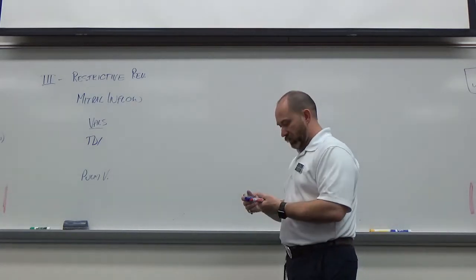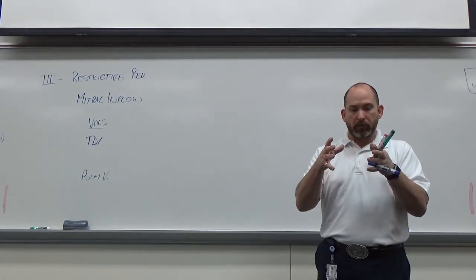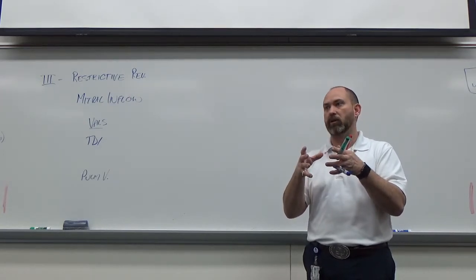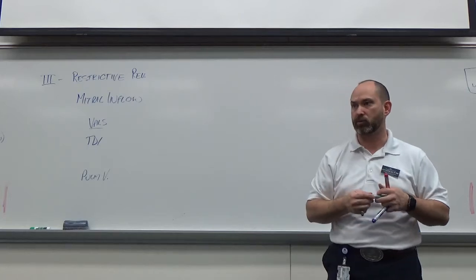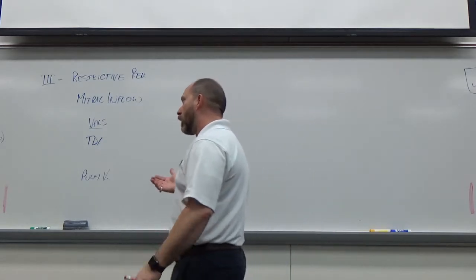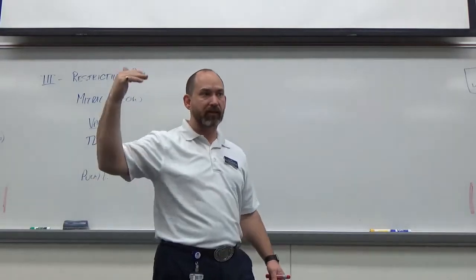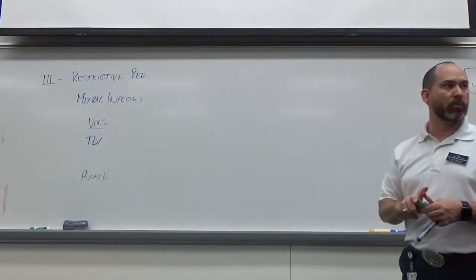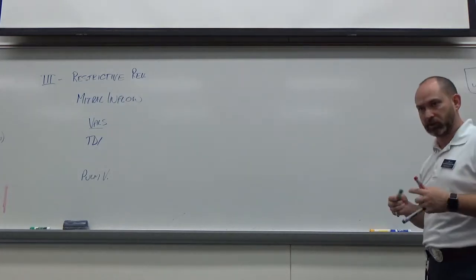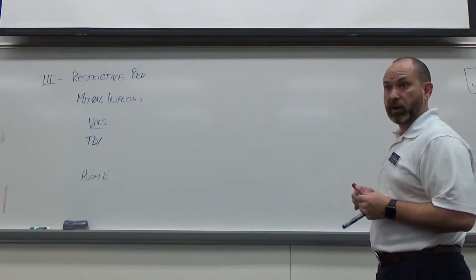All right, so mitral inflow, what does that look like for restrictive? Restrictive is a fundamental issue with the muscle itself. Something's going on in the muscle that's causing it not to function properly. Most people, even if they die of heart disease, are only going to get to the pseudo-normal stage. Restrictive is that next level of bad, where most people don't get to. They'll die from something else or some other heart-related cause. So if we're seeing restrictive physiology, that's pretty advanced.